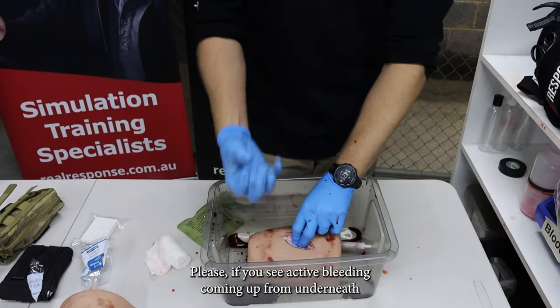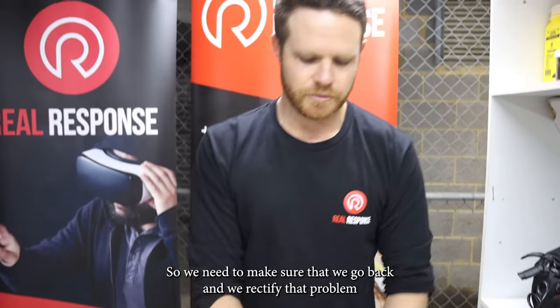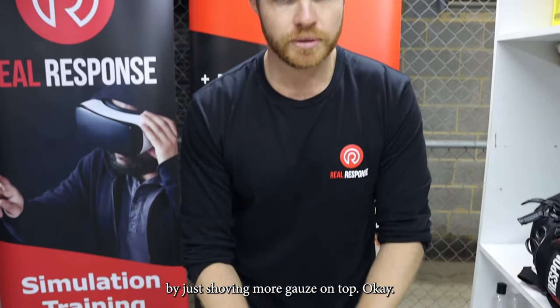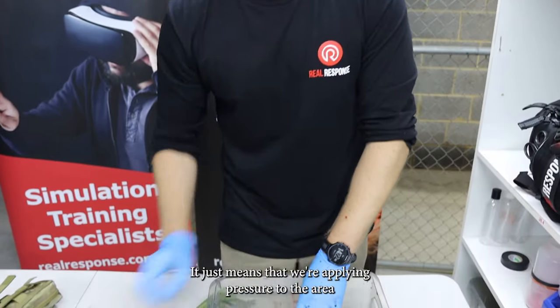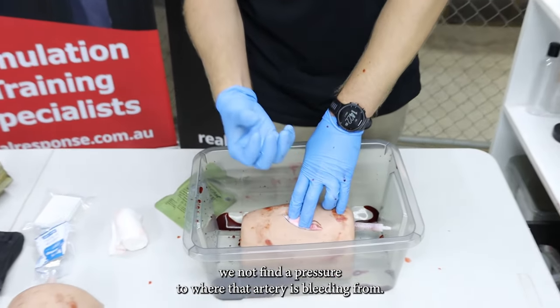Please, if you see active bleeding coming up from underneath, that wound is still bleeding — we need to go back and rectify that problem. By just shoving more gauze on top, you're only applying pressure to the area in general. You're not applying direct pressure to where that artery is bleeding from.